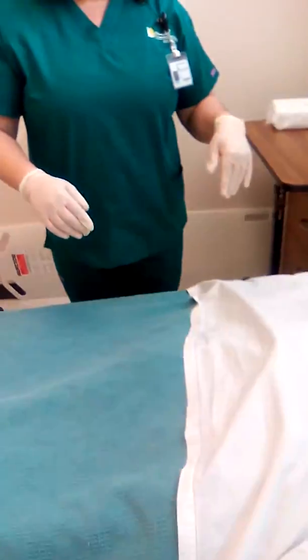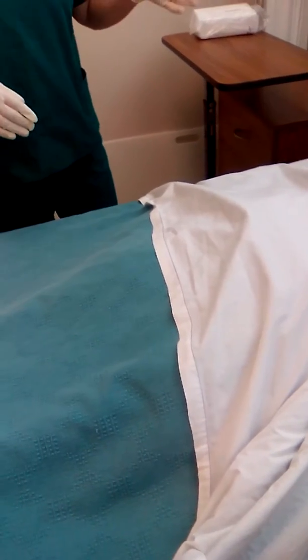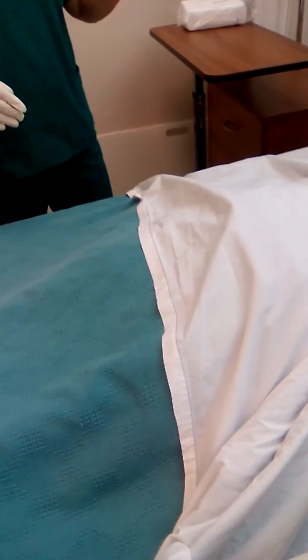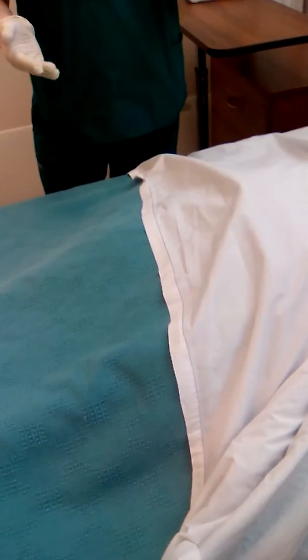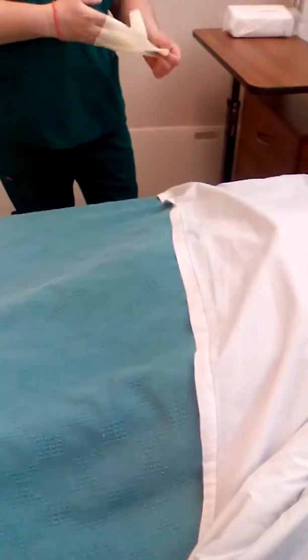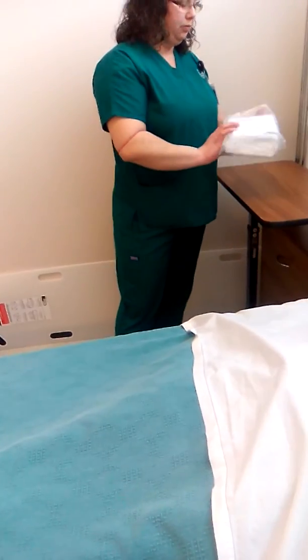And then I will also note when I was looking through my chart, any pathological reasons that would prevent the insertion of the catheter. And then after palpating the bladder, or possibly using a bladder scanner if available, I will remove my gloves, perform hand hygiene. I will go and gather my equipment according to physician order for the size and type of catheter.